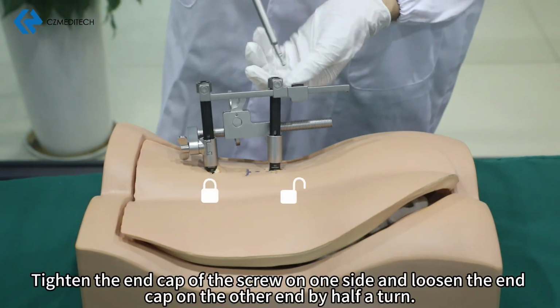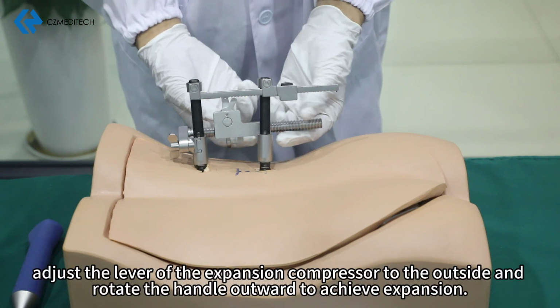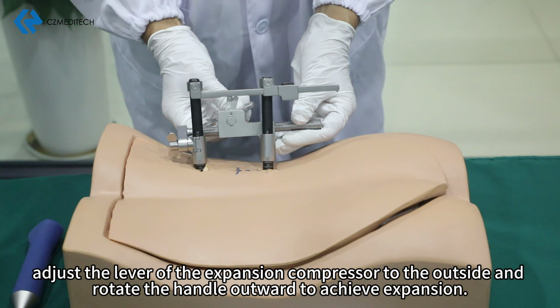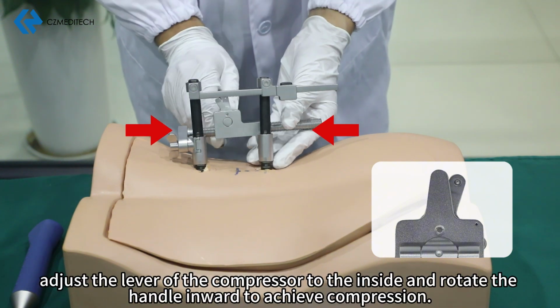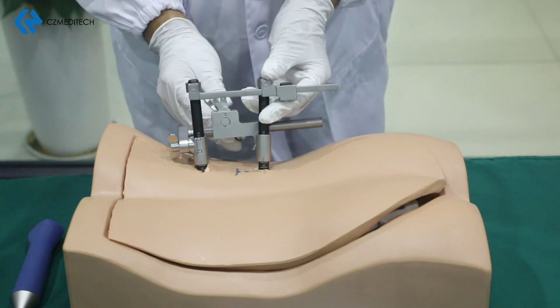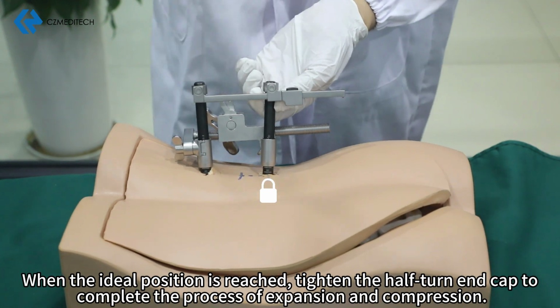Tighten the end cap of the screw on one side and loosen the end cap on the other end by half a turn. If expansion is required, adjust the lever of the expansion compressor to the outside and rotate the handle outward to achieve expansion. If compression is required, adjust the lever of the compressor to the inside and rotate the handle inward to achieve compression. When the ideal position is reached, tighten the half-turn end cap to complete the process of expansion and compression.